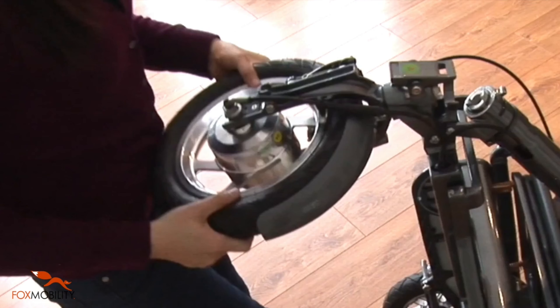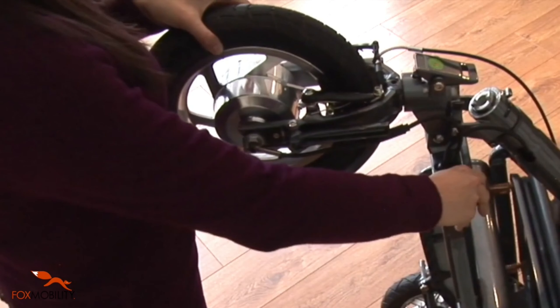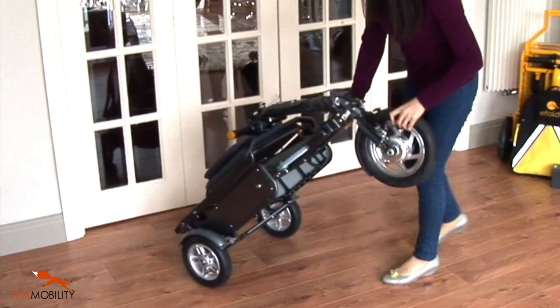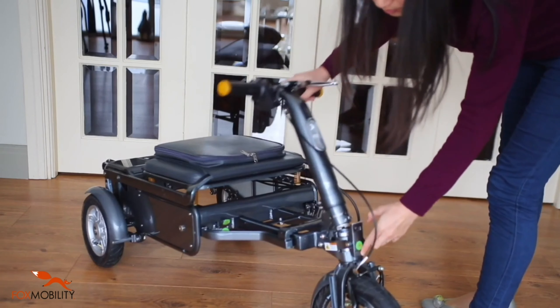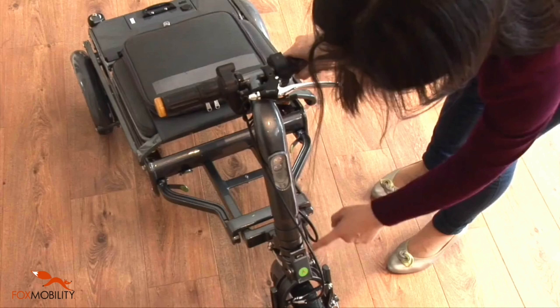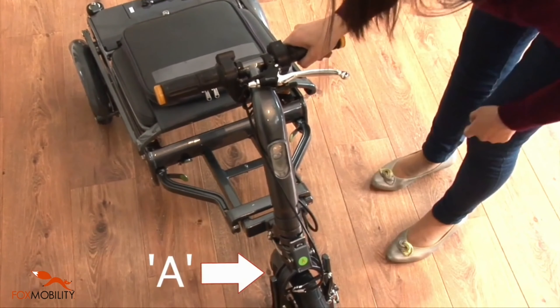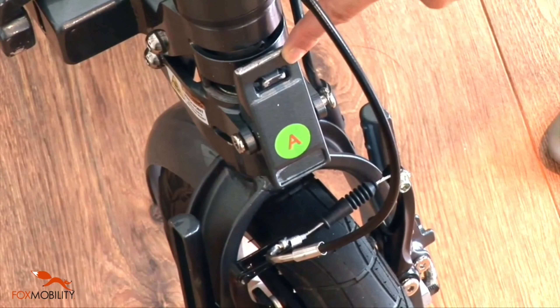Use both hands to lift the front wheel assembly. Use your right hand to grasp the front subframe and lower the front of the eFoldie to the ground. Make sure the wheel is pointing forward and the mudguard is at the back. Raise the handlebar assembly with your right hand and use your left hand to engage the steering latch A. Always verify that latch A is properly engaged as shown and the indentation is showing clearly.